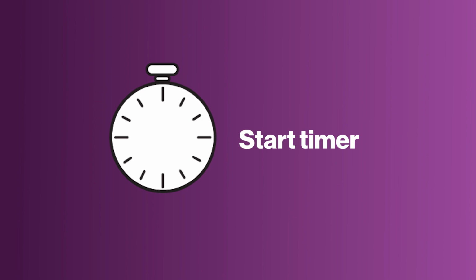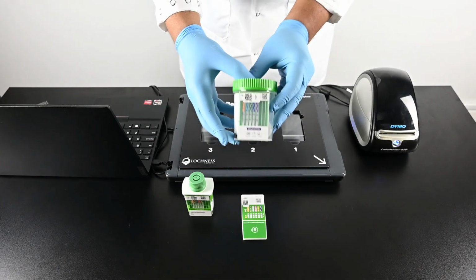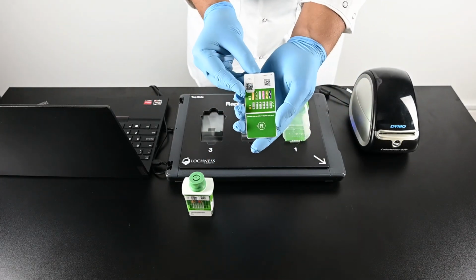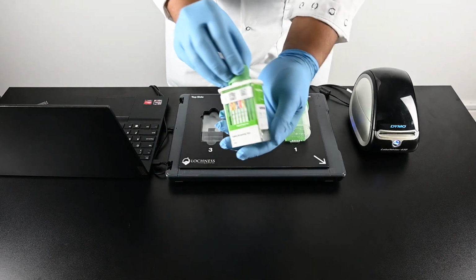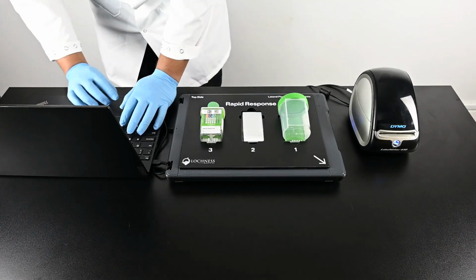Start a timer and wait the required time for reading the results. When the required read time has elapsed after sample collection, place the test devices onto the template on the Rapid Response Lateral Flow Scanner. Up to 3 samples can be analyzed at a time. 2-sided test devices can be placed with either side down.